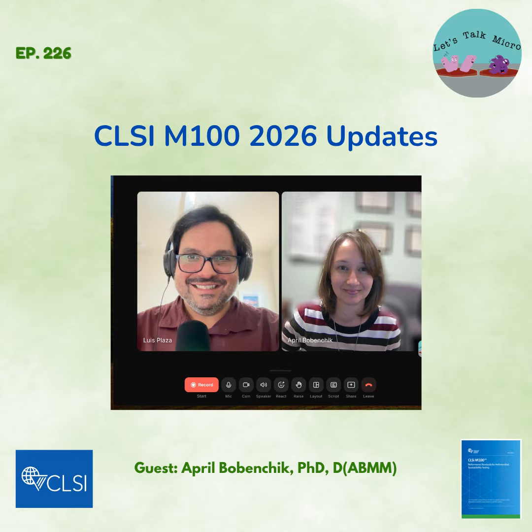Yeah, no, thank you for that. And I invite the audience, if you're working in micro, it should be somewhere over there, but if not, I invite you to read about this, and it's very fascinating, as you mentioned. When I first learned about aztreonam, it was very fascinating. And this is just very nerdy, but one of the ways that we tested for it in the lab was we did the synergy with aztreonam, because then avibactam was together with ceftazidime, which is the drug Avycaz. It's always such a cool nerdy thing when you see that it's just completely resistant, and then you do that synergy and you see the activity. So I just wanted to mention that.